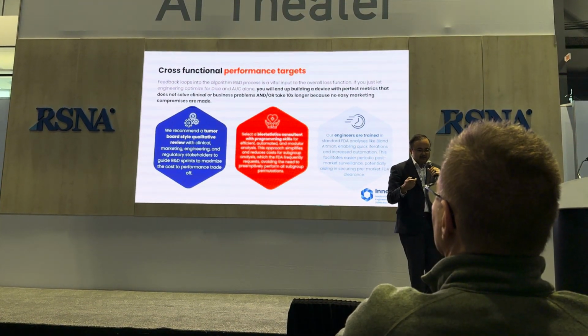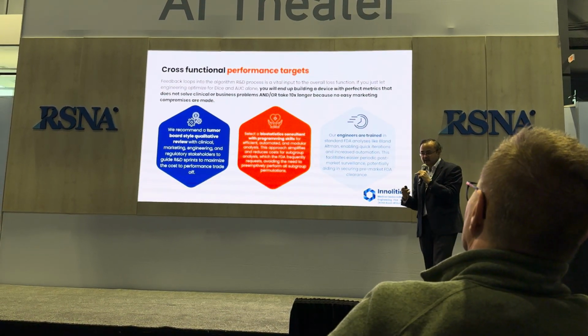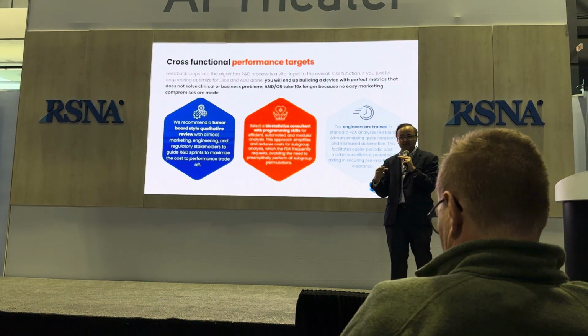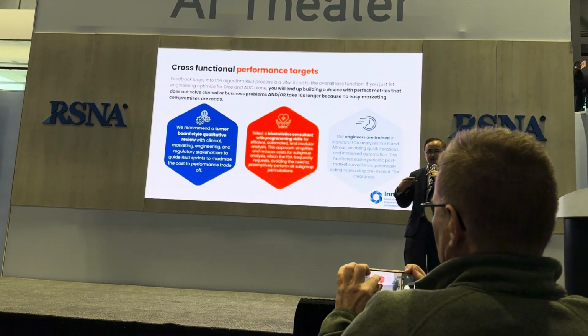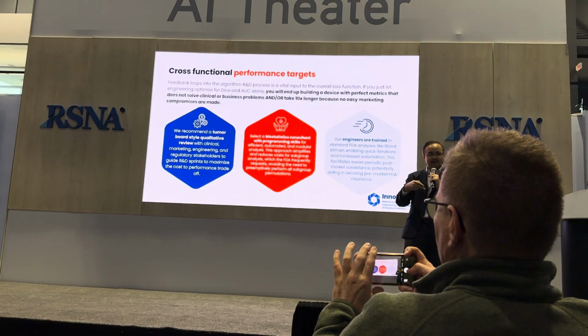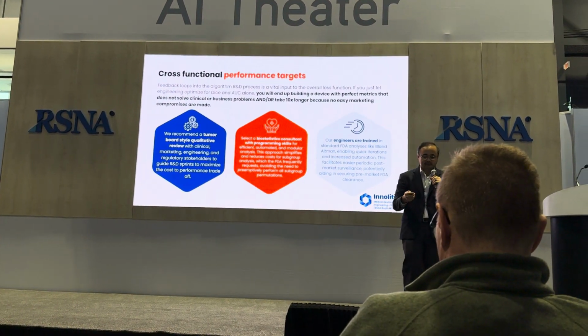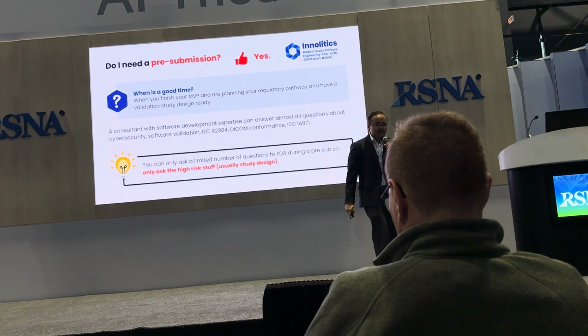Also, for biostatistics, we prefer to have biostatisticians with some amount of programming experience so that those analyses can be fully automated, because you'll be doing a lot of subgroup analysis as part of this process. When you get your feedback from FDA, almost always there's a subgroup that you haven't done that you'll need to do. So having some quick mechanism to repeat analysis in a subgroup will save you a lot of headache.